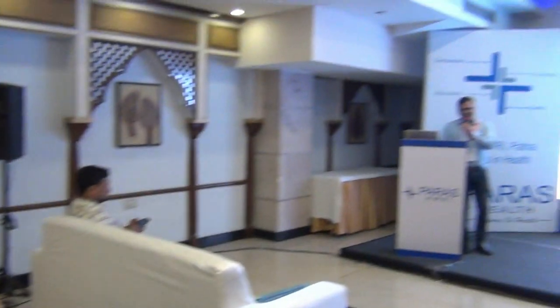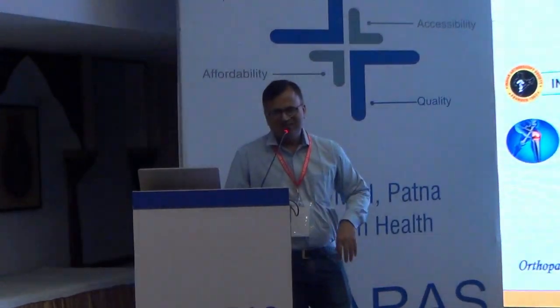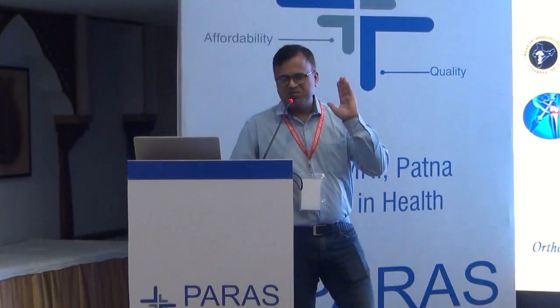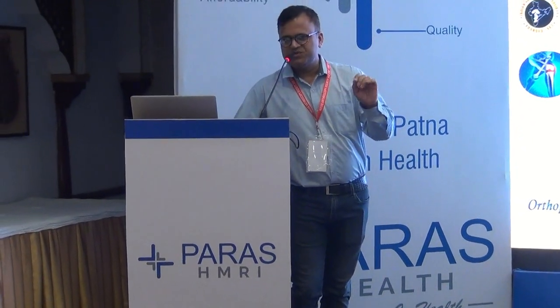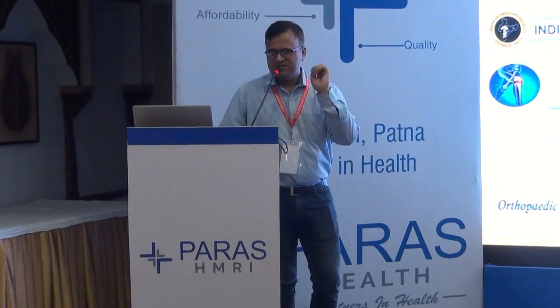So what are your tips to prevent the failure of repair in discoid peripheral meniscus? Yesterday I was doing one live surgery, and what we have shown in that case, maybe the things are the same. The posterior part is hypermobile. The posterior aspect of the lateral meniscus attached to the capsule is too mobile. You can just probe and it is coming out like that.